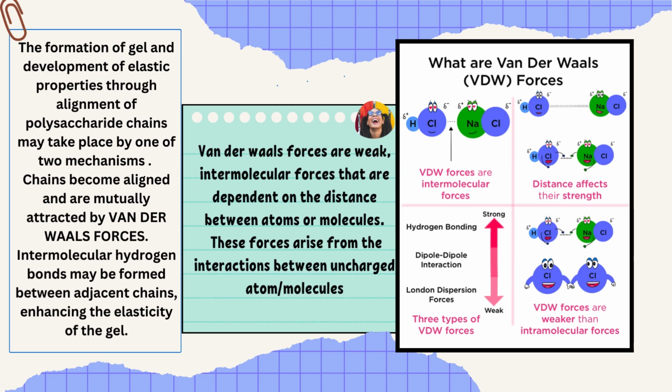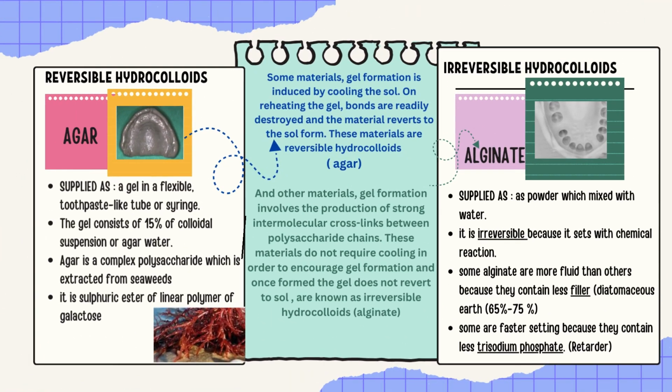Keep in mind that van der Waals forces are weak intermolecular forces that are dependent on the distance between atoms or molecules. These forces arise from the interactions between uncharged atoms or molecules. As you have gone through the basics of hydrocolloid impression materials, now let me tell you about agar and alginate.